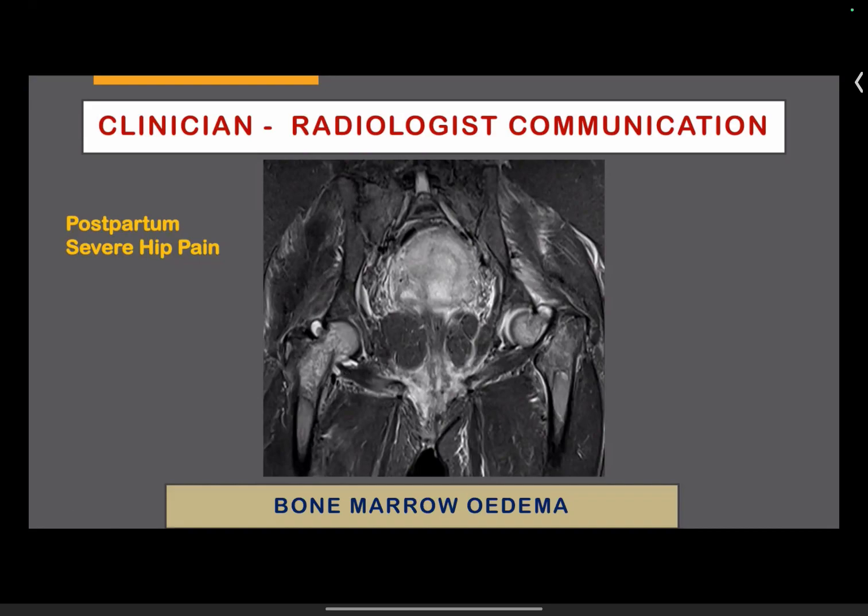And so most of the time when we image in acute MSK, particularly regarding the MR, we look for bone marrow edema, right? But for us, it's important to identify where it is and then why it is. That's where our clinical acumen or experience comes into play.